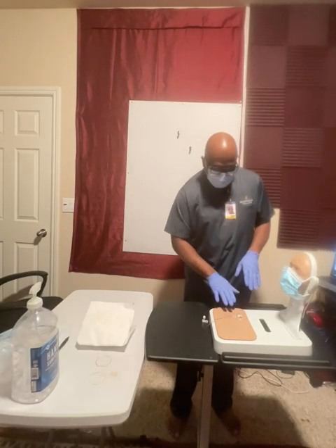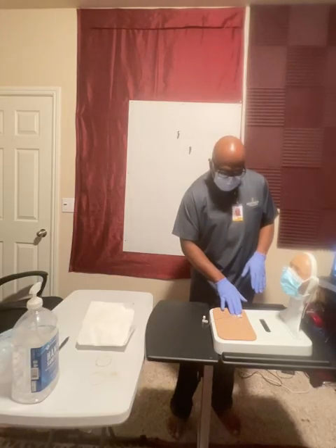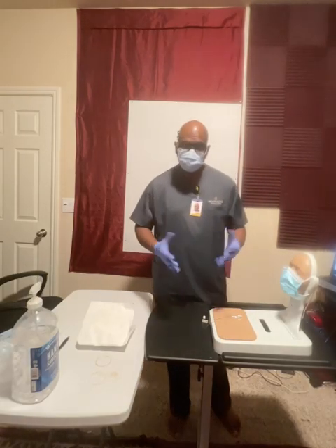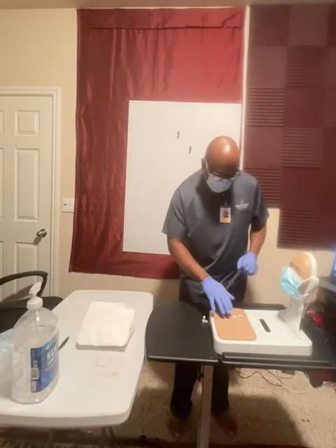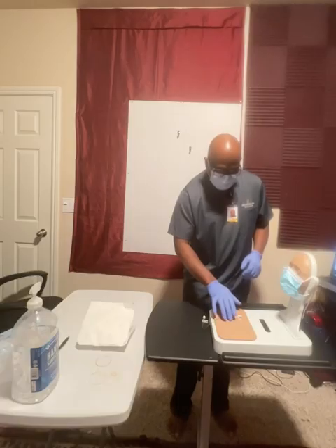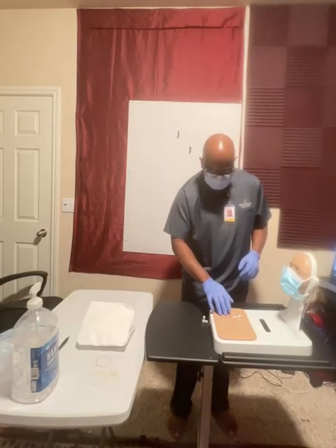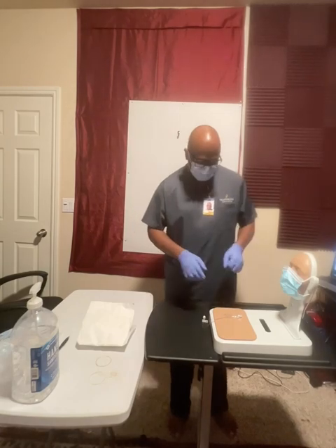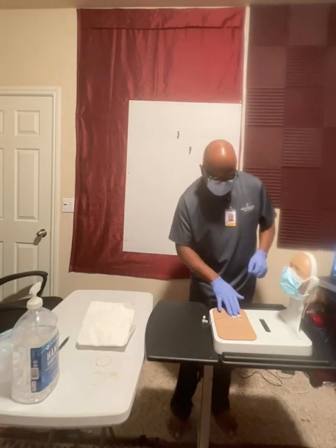I'm also going to be palpating, right, for tenderness. But not only am I palpating for tenderness, but I'm also palpating for the temperature of this site, right? Just to make sure there's nothing going on here. I'm going to ask the patient, does this hurt? Do you feel any kind of tenderness or any soreness here? Right? Because I need to document that. I need to communicate with the healthcare provider on that as well.